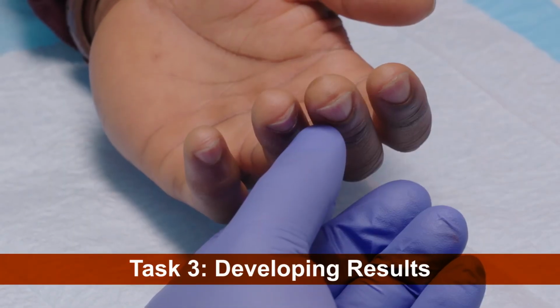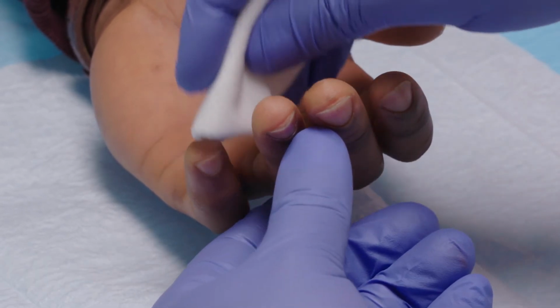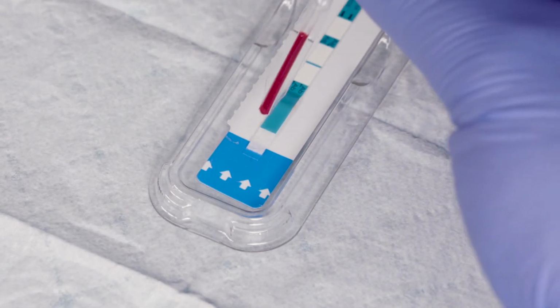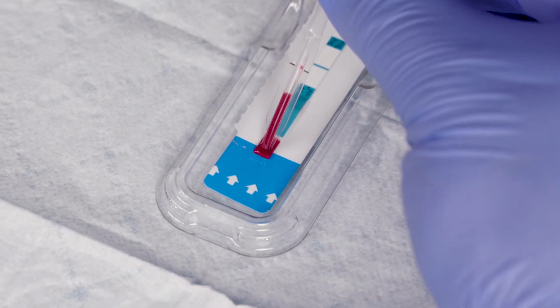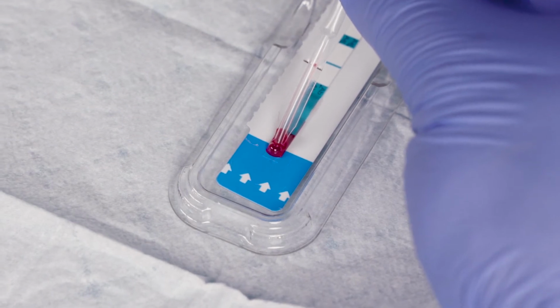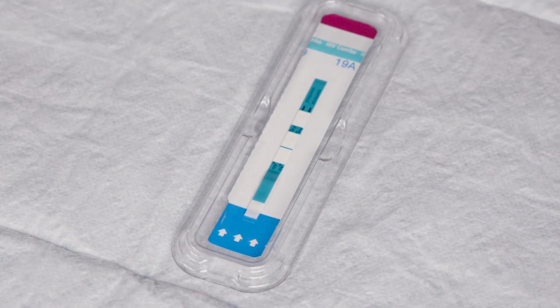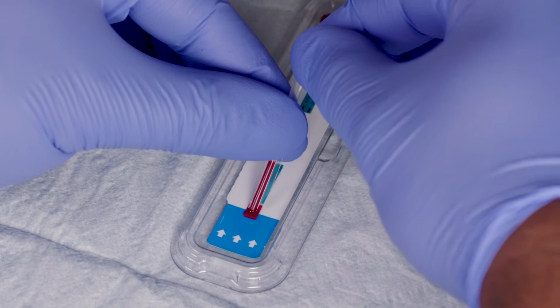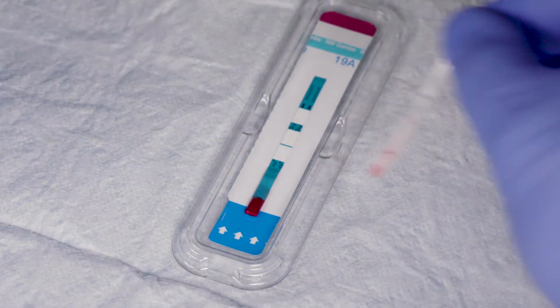When you've collected the sample in the disposable capillary tube, place cotton gauze at the finger stick site and ask the client to hold it firmly against their finger. You will continue with the test and touch the tip of the tube to the sample area to deposit the blood onto the test strip. Do not lift the capillary tube from the sample pad before all the blood has been transferred. If a sample won't expel, cover the small opening at the mark of the capillary with a gloved finger. Then squeeze the bulb until the sample is fully dispensed onto the sample pad.